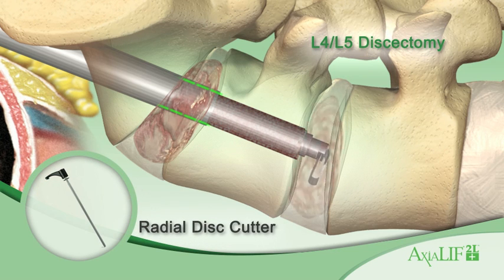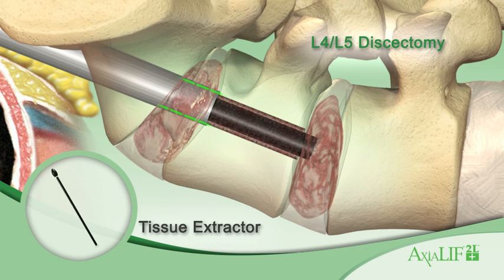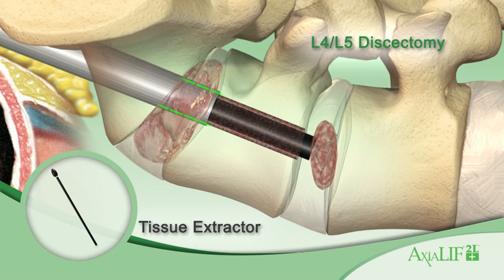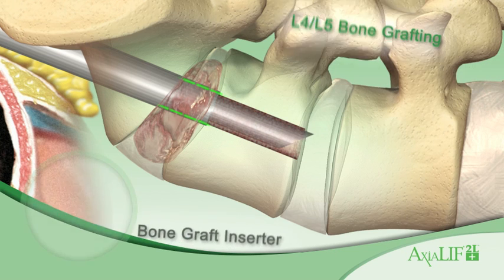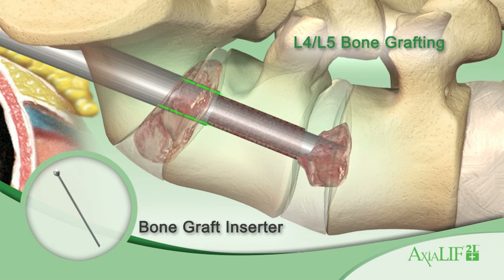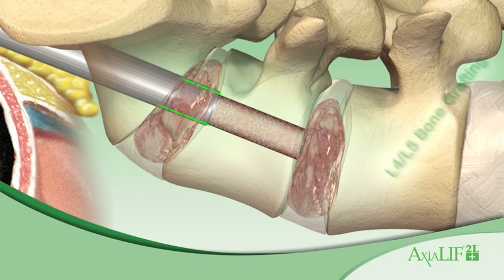Perform the second discectomy at the L4-L5 level using the same series of nitinol disc cutters and endplate rasps. Extract the diseased disc with the tissue extractors. Fill the disc space using the bone graft inserter with a mixture of autologous blood and demineralized bone material.